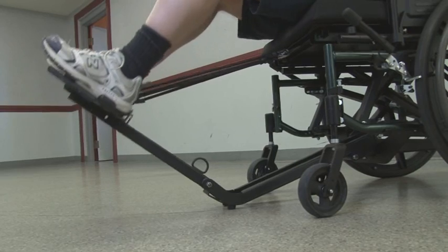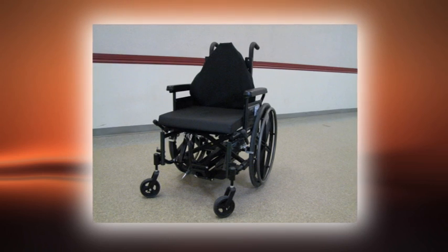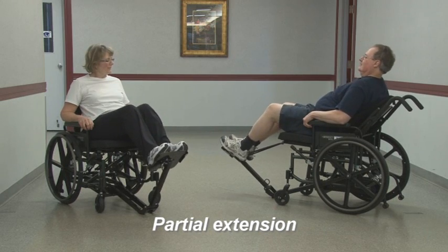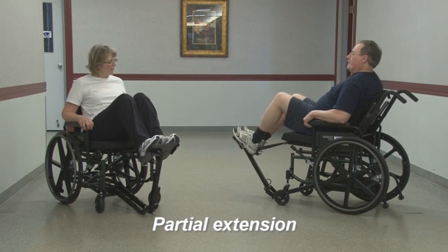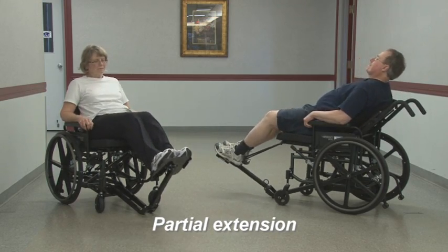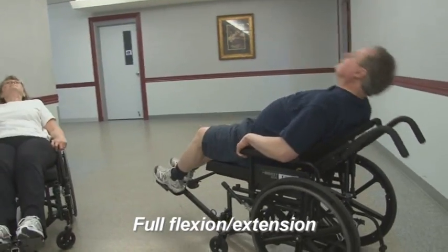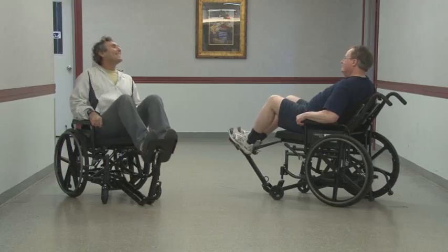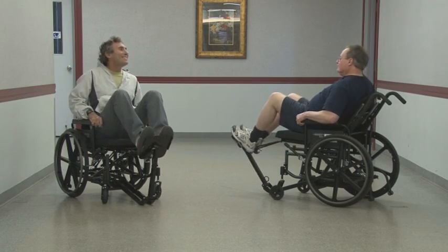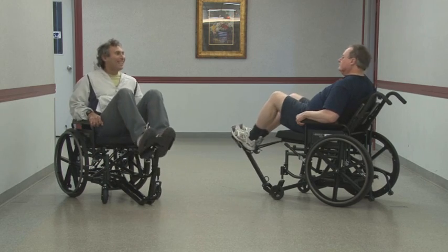Other than its unique functionality, the exercise wheelchair looks and functions as a standard wheelchair. The range of motion and intensity of the exercise can be gradually increased from minimal motion to full flexion extension of the trunk and lower extremities. Similarly, the pace of exercise may be increased to raise the level of difficulty.